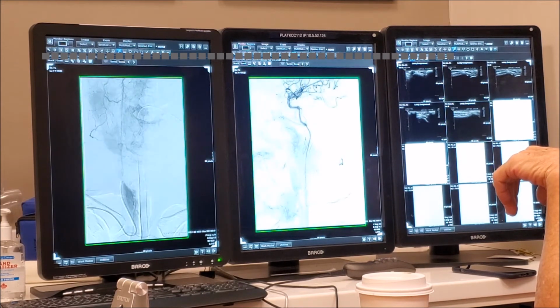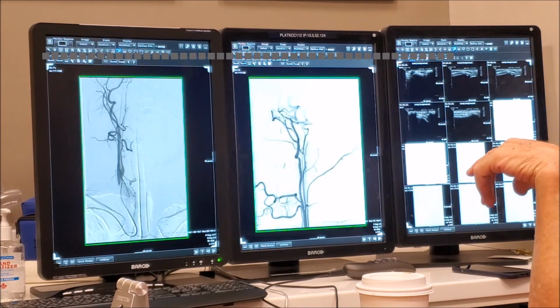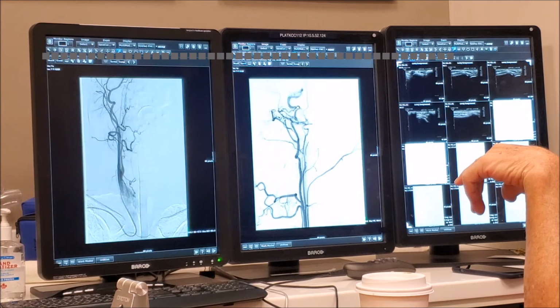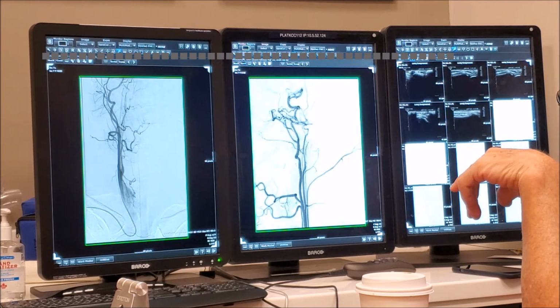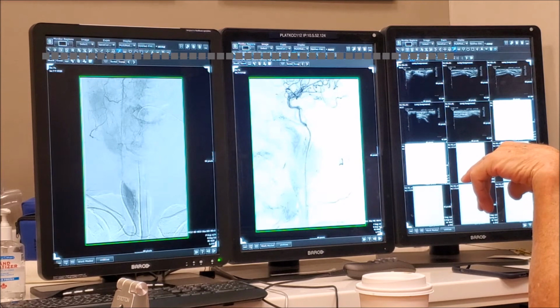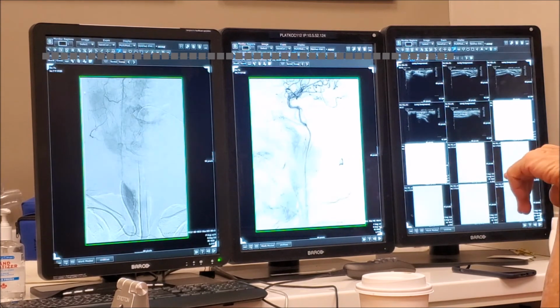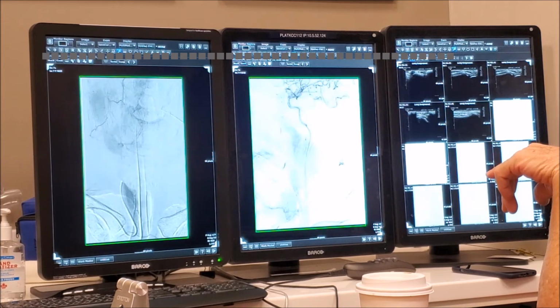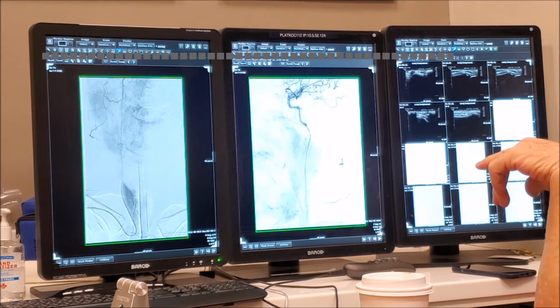Oof, this is really good. Okay, you see, fabulous, I figured it out. So now I have this foramen rotundum and probably foramen ovale, and they are coming like that and reconstituting the carotid. Look, this carotid, but it's feeding backwards like this. And now that connects to this, which is the stump of what we saw here. And that point of changing caliber is the foramen lacerum? Yes, it's foramen lacerum, correct.